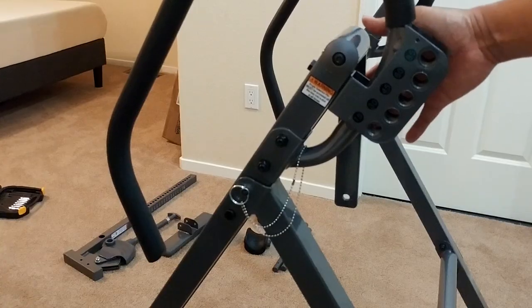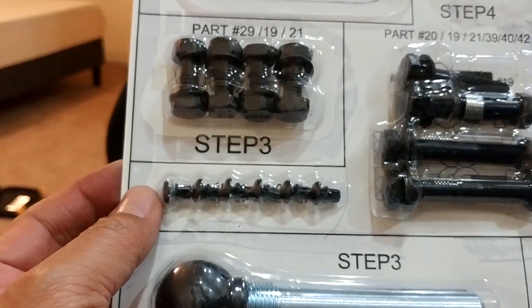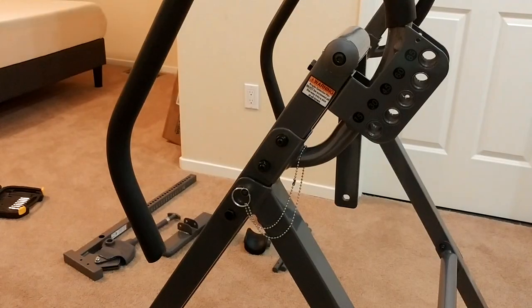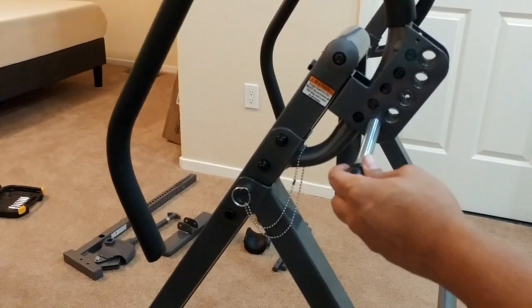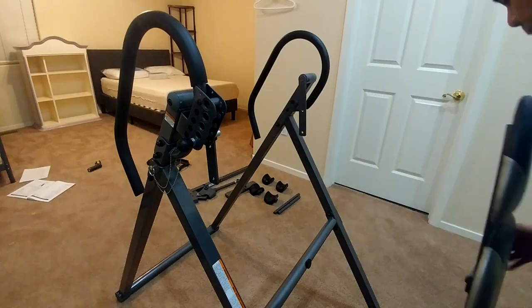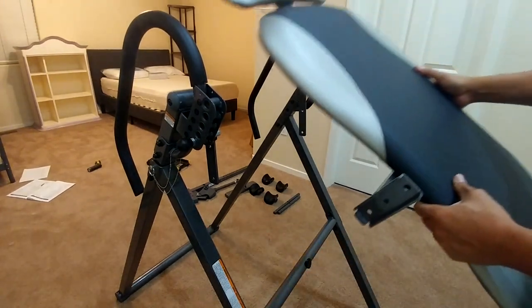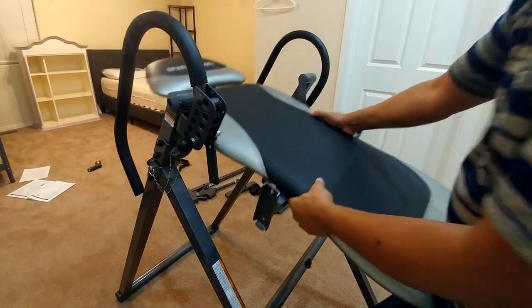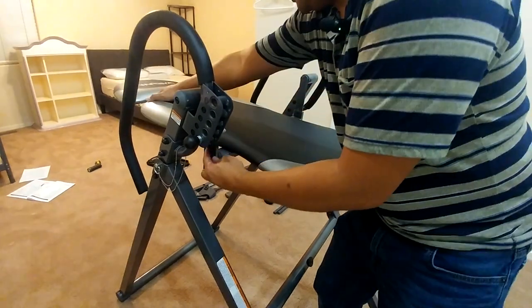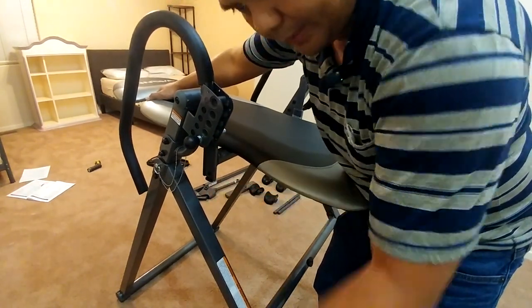Next is to install the backrest. For installing the backrest you're going to use step three: the lock pin and the screws. Before you install the backrest, make sure you put the pin in so it doesn't move. To install the backrest, you want the bottom pointing down toward the crossbar. Go ahead and insert it, and put the hardware in on both sides.